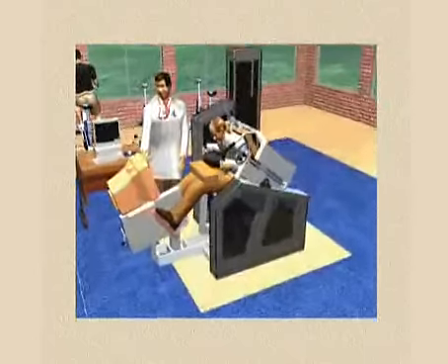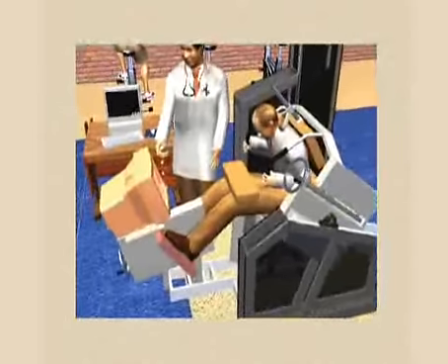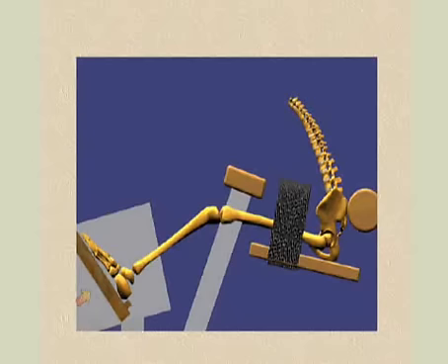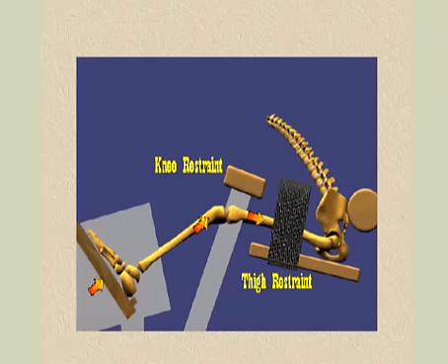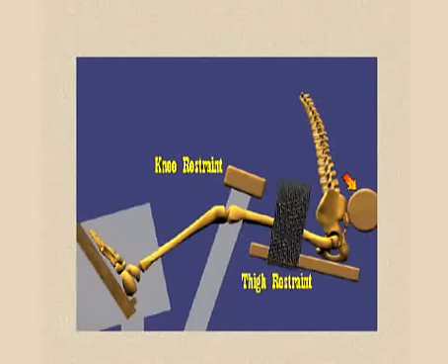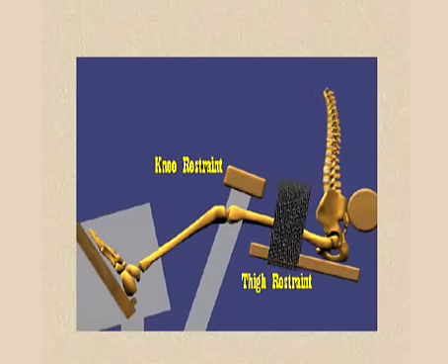This can only be accomplished using the specialized MedX lumbar extension machine in the following manner. An adjustable footrest is used to apply a force along the long axis of the lower legs that moves the legs upward and back. However, the knee and thigh restraint prevent any vertical movement of the legs and redirects the force down the femurs so the pelvis is pushed back into the circular pelvic restraint pad. The combined action of these restraints prevents backward rotation of the pelvis during the exercises and ensures proper strengthening of the low back muscles.